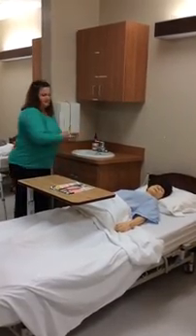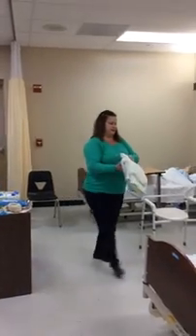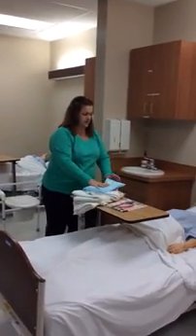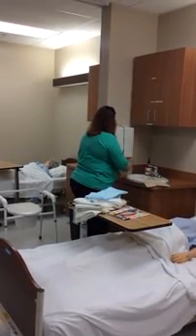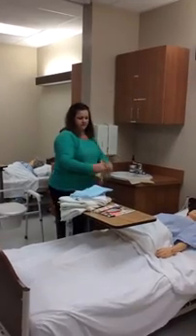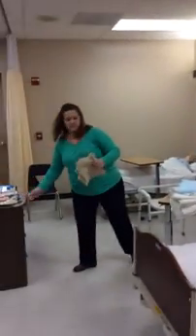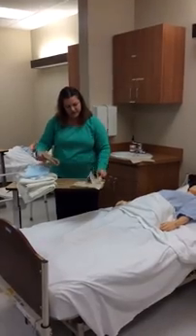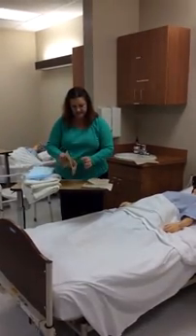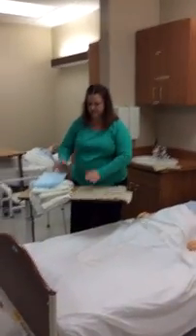Washing my hands. The supplies I need are bath blanket, towel, 2 washcloths, and a disposable pad. You can choose to use paper towels as a barrier, or you can get one of these disposable pads. I just choose to use paper towels so I don't waste my disposable pads, but do whatever you need to do for your test.